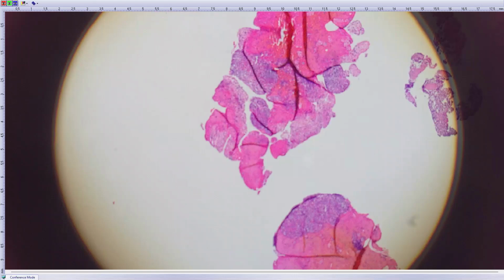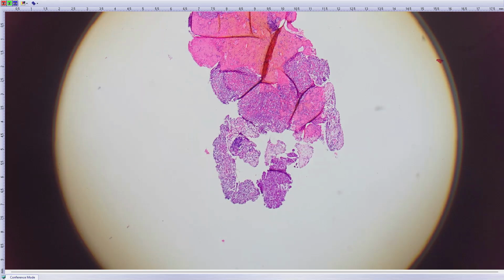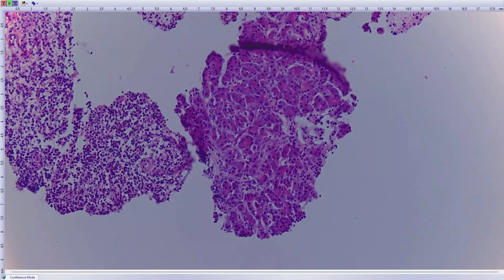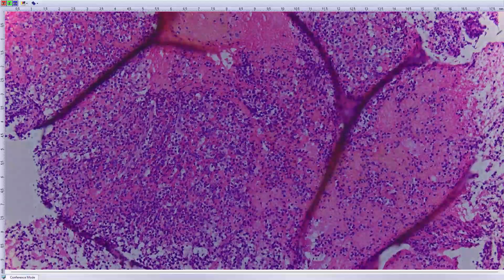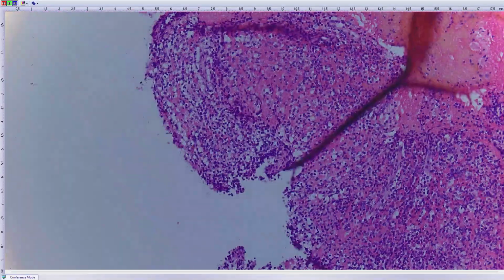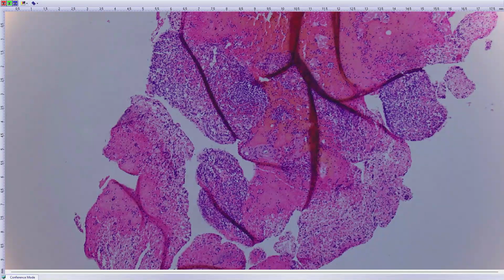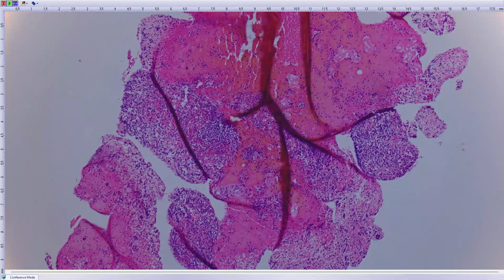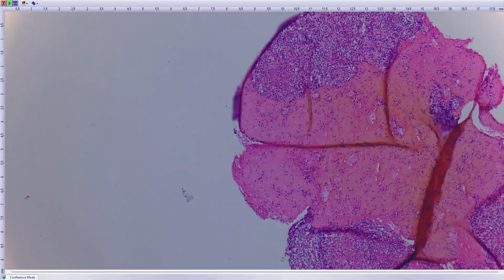My last case for today is a biopsy from a mass from the tail of the pancreas. You can see pancreatic tissue here, and this little bit lymphoid-like tissue here. The question was, is it a neuroendocrine tumor? Because on ultrasound it was a roundish lump next to the tail of the pancreas. So any suggestions from here?